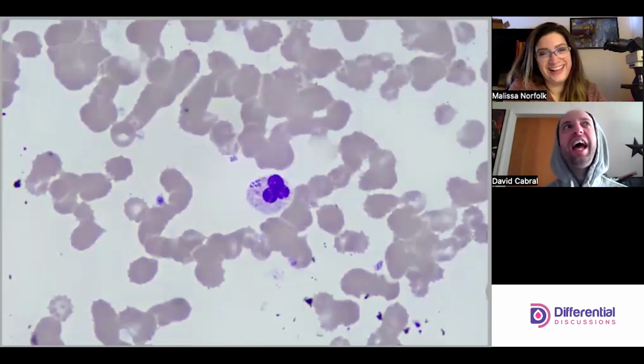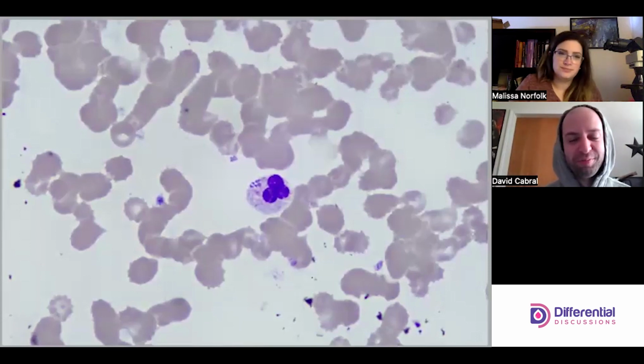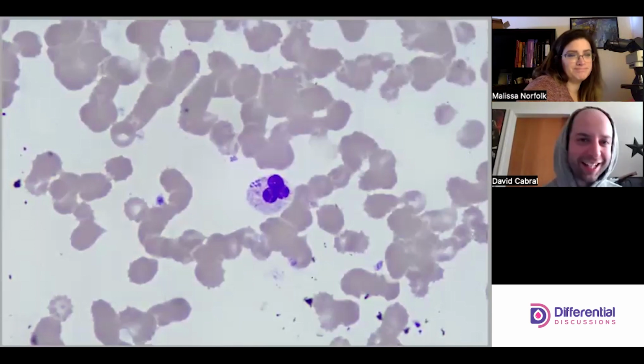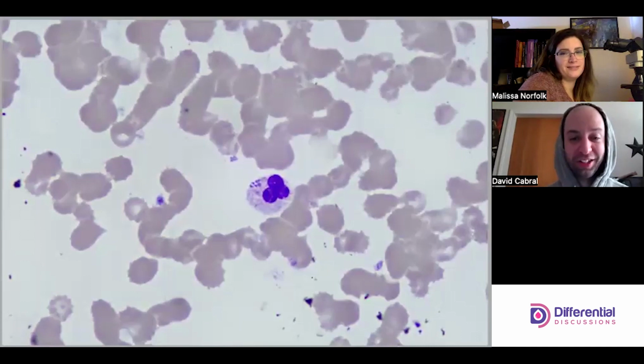I remember after we had seen an anaplasma, there was a scare because we had a really ill patient with a lot of inclusions in the neutrophils, but they didn't look like this. It's just way more subtle. Like with eosinophils, sometimes you wonder, is that an EO? And when you see one, it's always affirmative. Wow, this is a morula and several organisms inside this neutrophil. The cell looks perfect too.